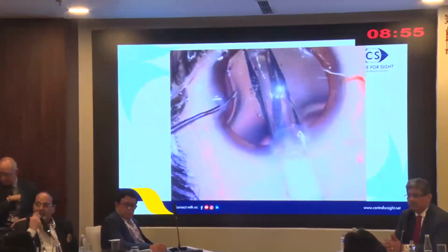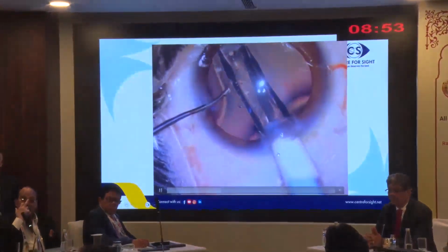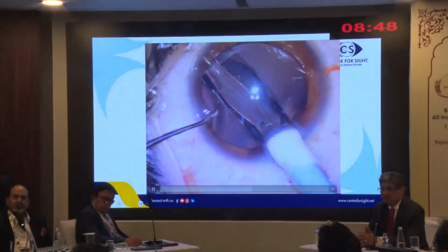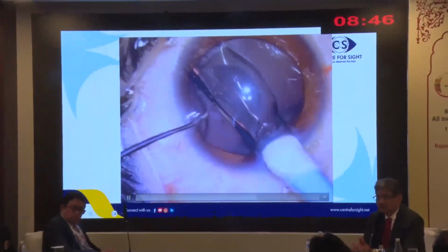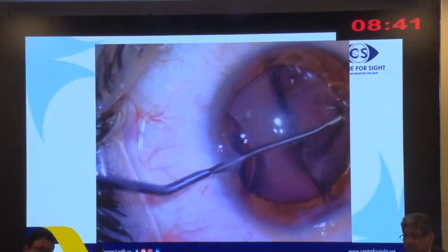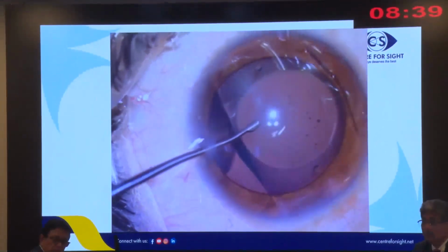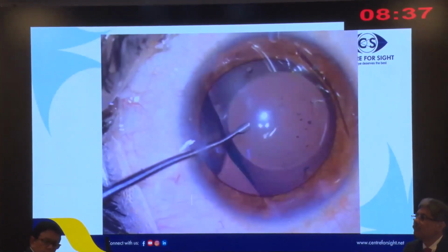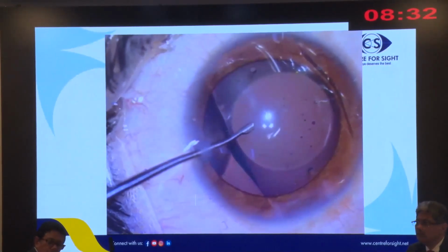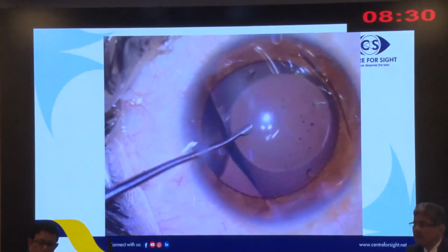One important thing is that once you are doing cataract surgeries, you also think that you can do an ICL, but you need to look at it. It need not be wound assisted, and if the ICL gets stuck in the wound, like it is getting stuck here, it has a tendency to roll over. Depending on the level at which it is opening, you can withdraw it. That is very easy, and then you don't damage anything.